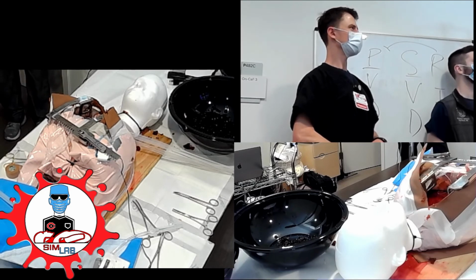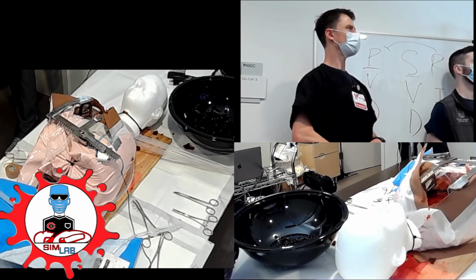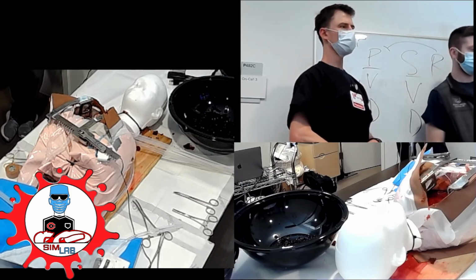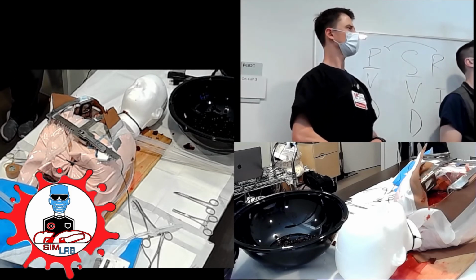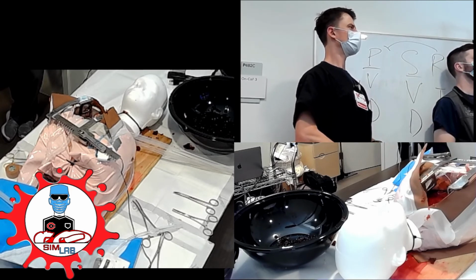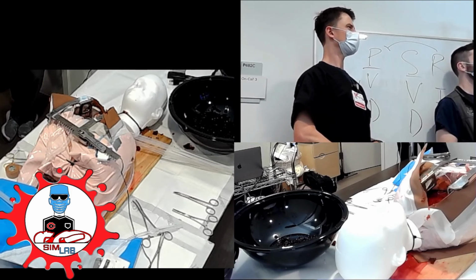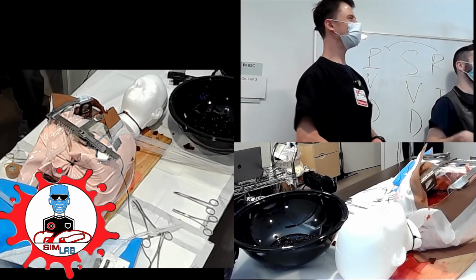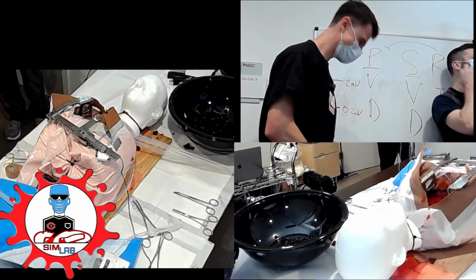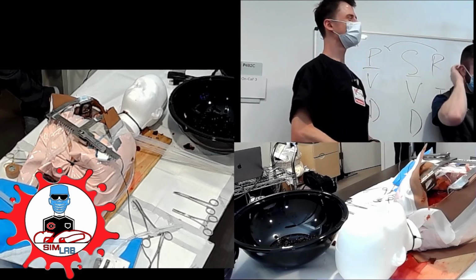I have a quick question about when you're checking somebody's underlying rhythm post CABG. When you're turning down the rate, let's say the baseline rhythm is 60, how do you go all the way down to 0 and find out? Or do you get to like 30 or 40 and you're like, okay, I don't see anything, I'm going back up?